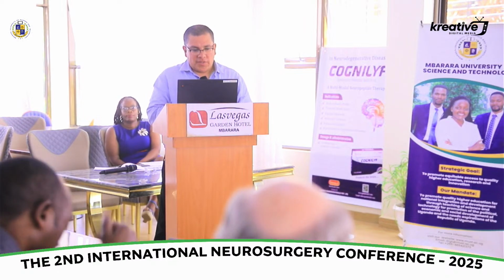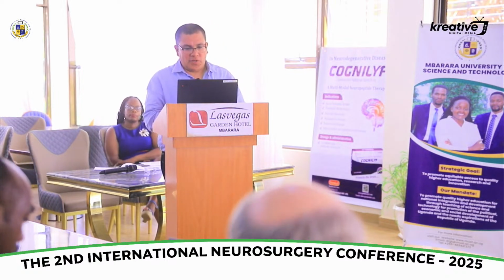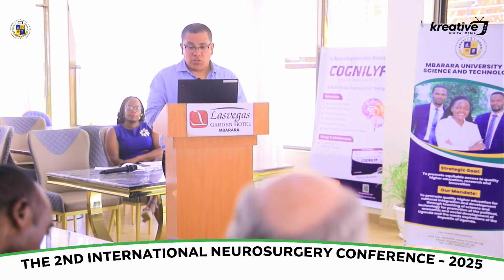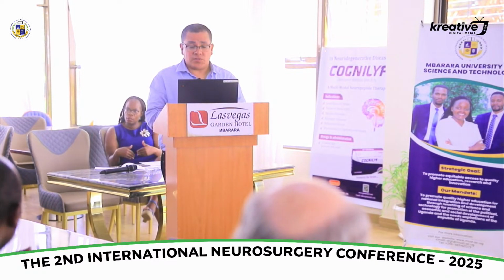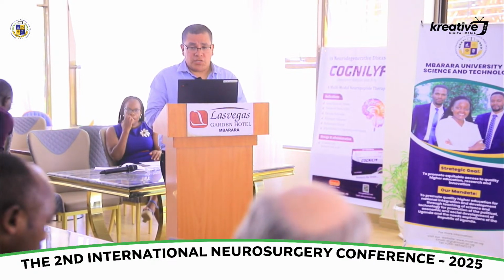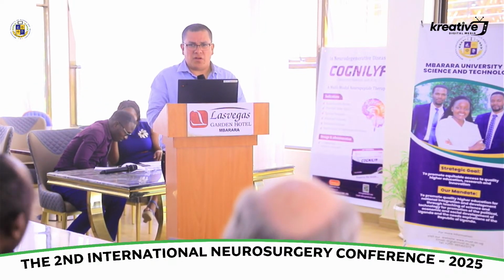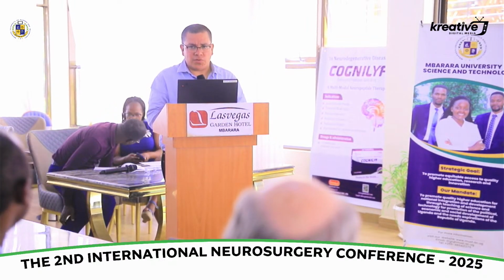So let's talk a little bit about the intracranial vascular anatomy with ultrasound that I find really useful. The main modality that we use in the ICU at our institution is transcranial Dopplers, and we use it mostly for the determination of cerebral vasospasm. Looking at your machine last year, I saw that there is a setting for TCDs, so depending on how many hertz we can actually use, maybe we can do a demonstration when we are in the hospital.